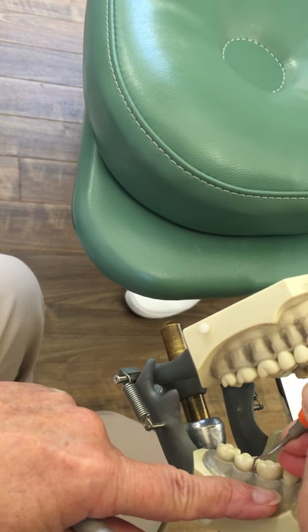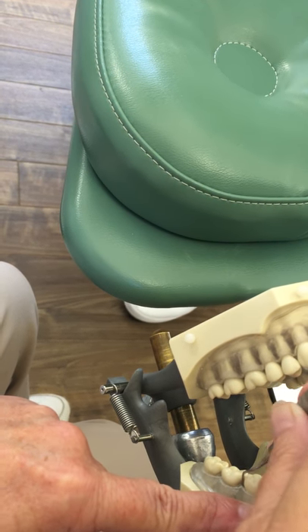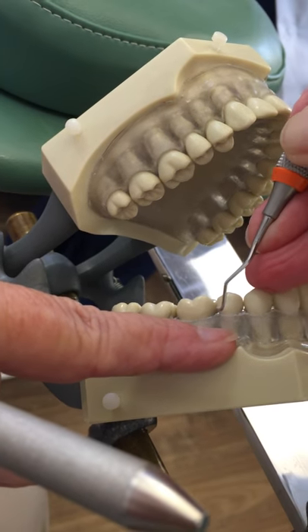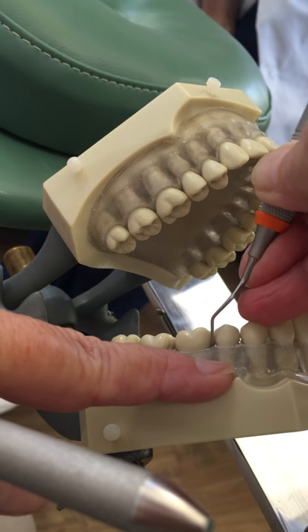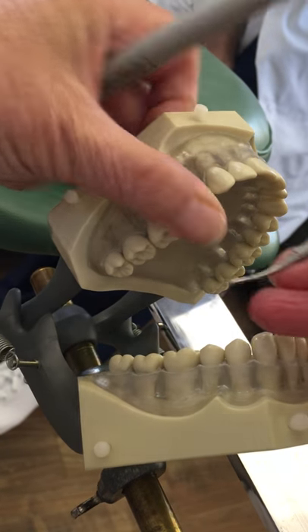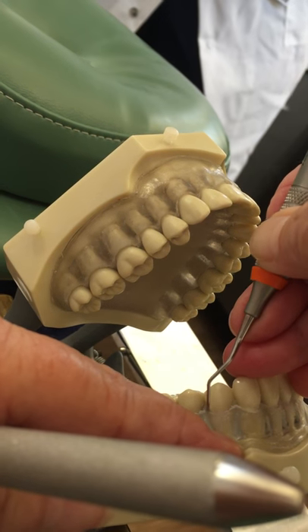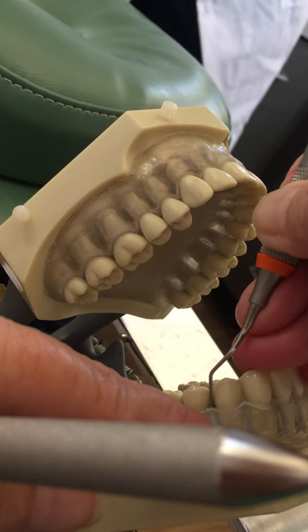Toe to tooth. Right now I'm just in the cervical third, but if I needed to go deeper, I would. As you come around here, if you need to straighten up your mannequin — my mannequin is turned slightly away, I'm kind of at nine o'clock. So as you get to these premolars and the arch is beginning to curve, straighten up your mannequin slightly.